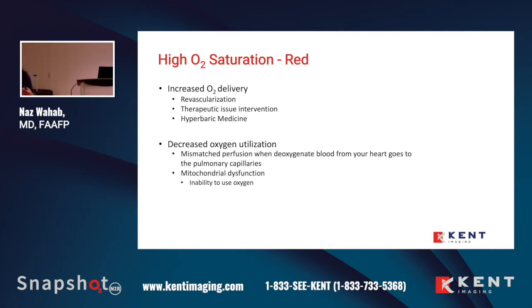High oxygenation will fluoresce red. And so what does that mean? Increased oxygen delivery. So we utilize this in many different ways. And obviously one would be revascularization, pre and post intervention. Could we see an immediate improvement in that tissue oxygenation there? Yes, we can.